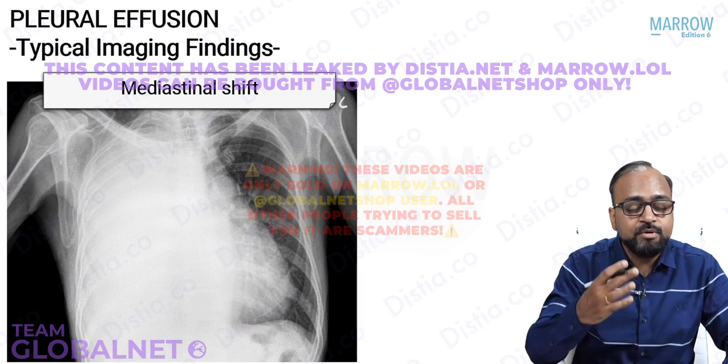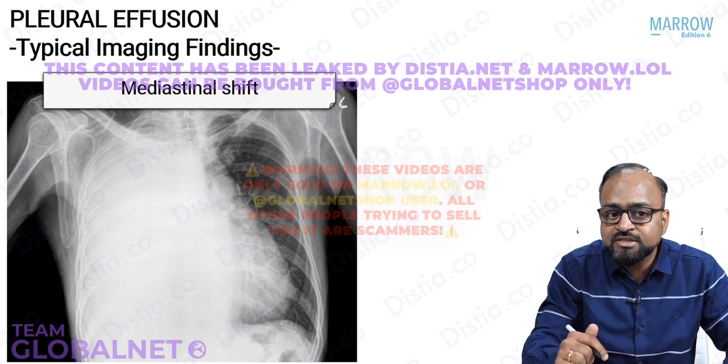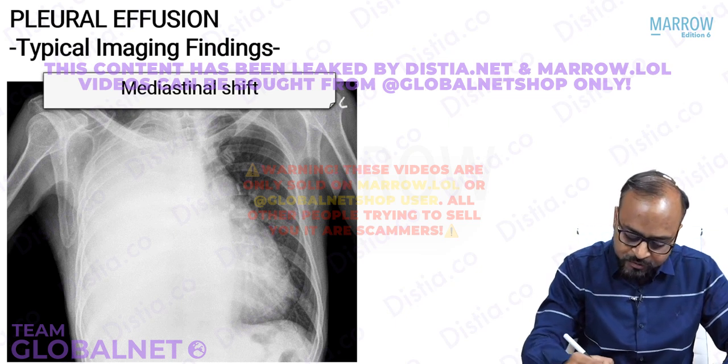The mediastinum there will be a mass effect on the mediastinum. It will be pushed to the opposite side. Where is the mediastinum here? Just watch carefully. Look at the trachea. I am going to trace the black lucent tube of the trachea in this radiograph. See here. Can you see? This is the trachea here.